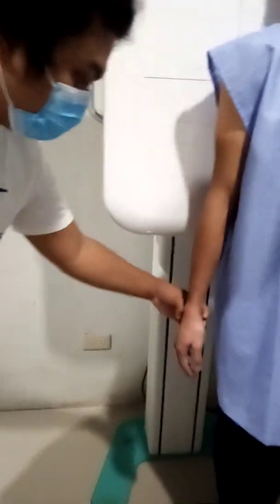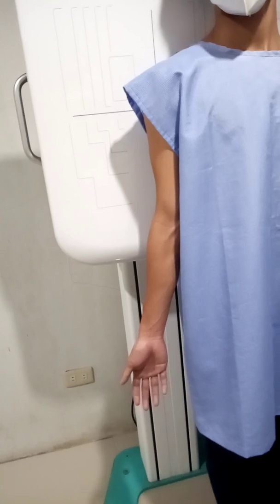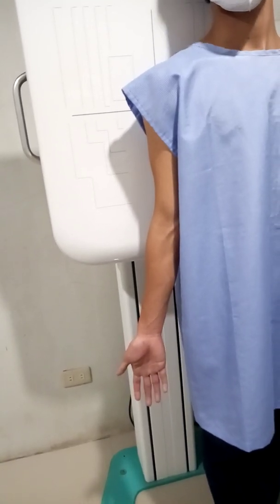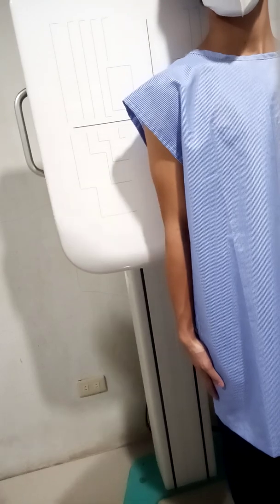This is the external rotation of the humerus. So for the neutral rotation of the humerus, ask the patient to rest the palm of the hand against the thigh. This is the neutral position of the humerus.